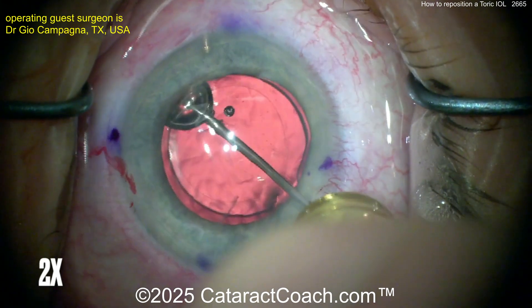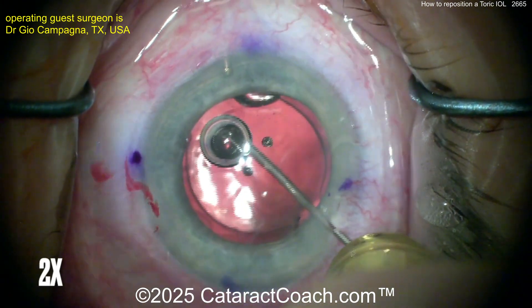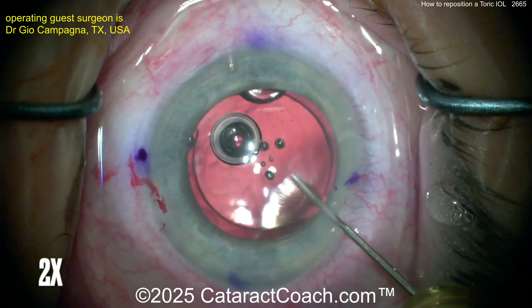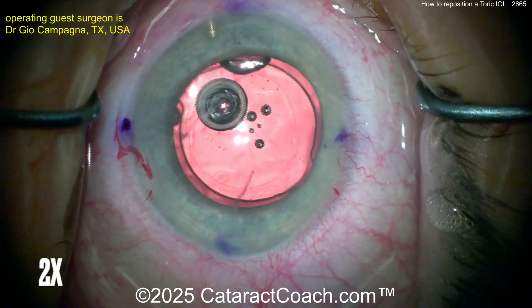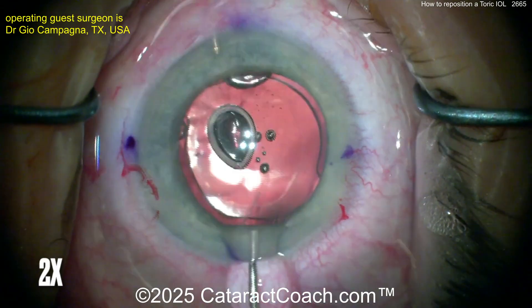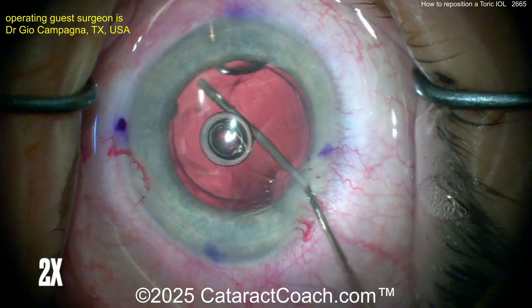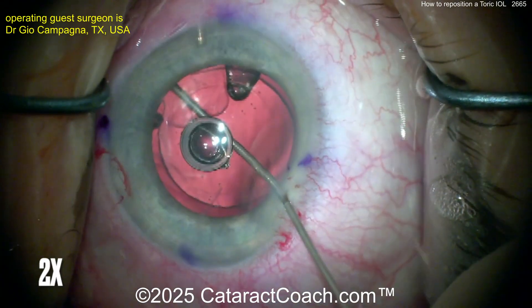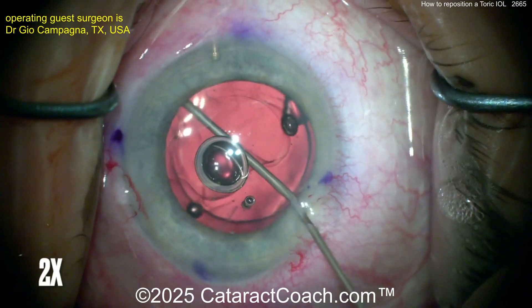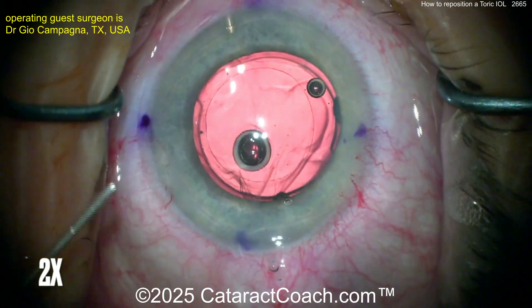Using a sharp 27-gauge needle on the viscoelastic — maybe get the air bubbles out — you want to get under that rhexis edge and create a viscoelastic wave. You may have a little bit of a gap there. Now switch back to a blunt 27-gauge cannula, go underneath that same little gap, and inject a dispersive viscoelastic to separate the IOL from the capsule bag. You need to separate both the haptics and the optic — really free this lens up from the capsule bag.